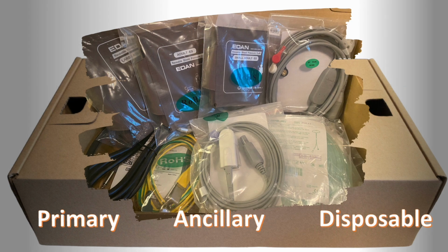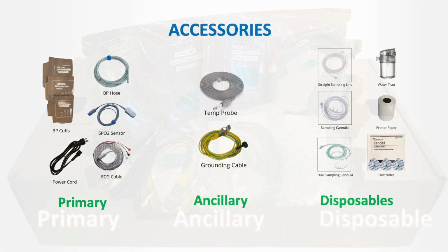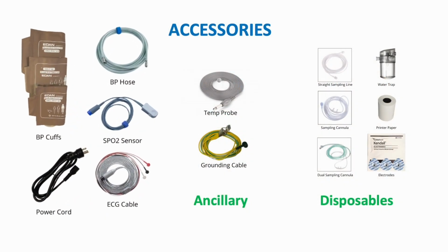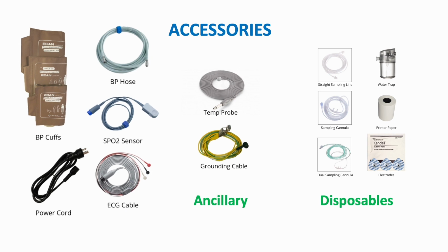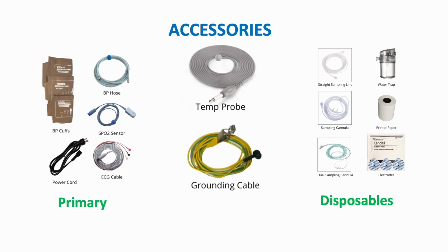Let's start by sorting the accessory box into primary, ancillary, and disposable accessories. The primary accessories include 3 blood pressure cuffs, blood pressure hose, pulse oximeter sensor, ECG cable, and the power cord. The skin temperature probe and grounding cable are considered ancillary items and not generally utilized.